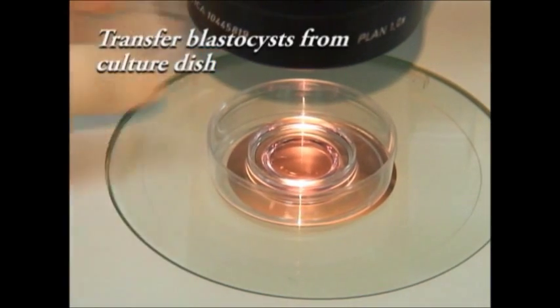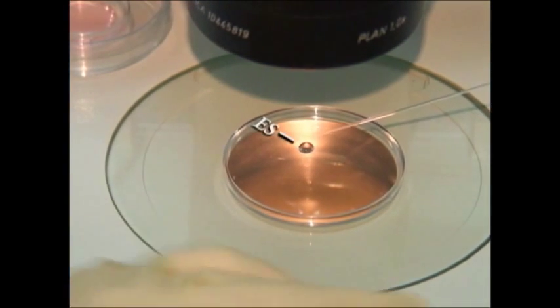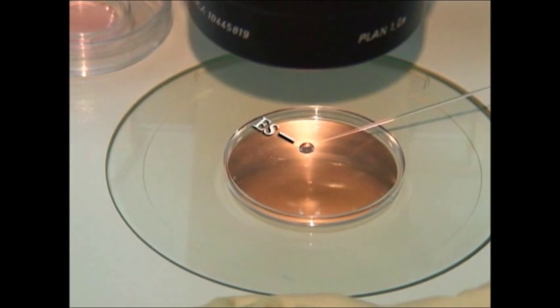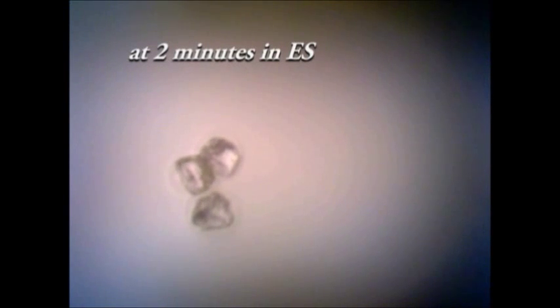If blastocysts need to be vitrified, they are kept in the equilibration solution for up to nine minutes. At around two minutes, you could see the embryo shrinking and equilibrating and by nine minutes, they have expanded to the original size confirming equilibration.